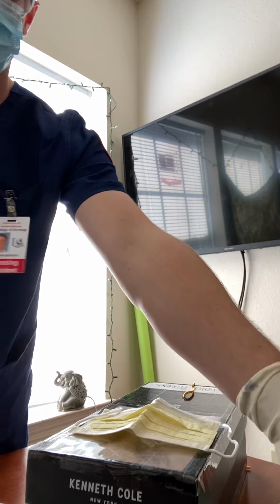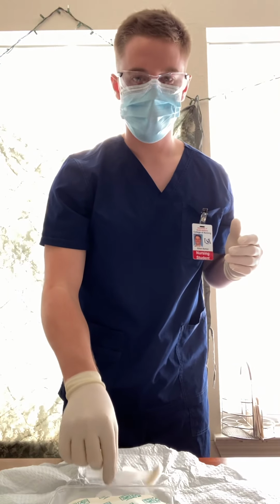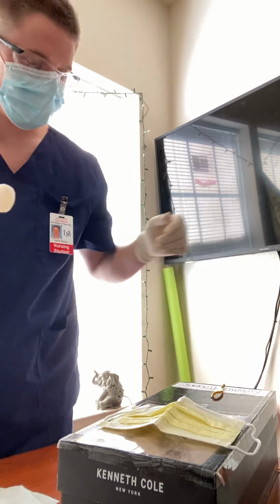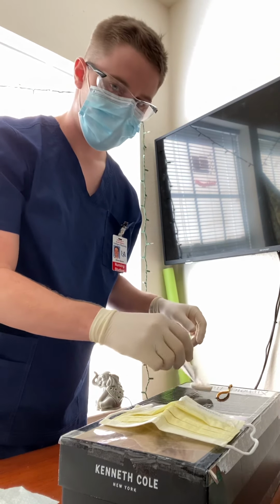I'm going to break sterility again and turn the camera. Then I'm going to get my chlorhexidine. I'm going to break it, you'll hear a click. I'm going to move the camera again. And then I'm going to clean. Now I'm going to clean vertically.